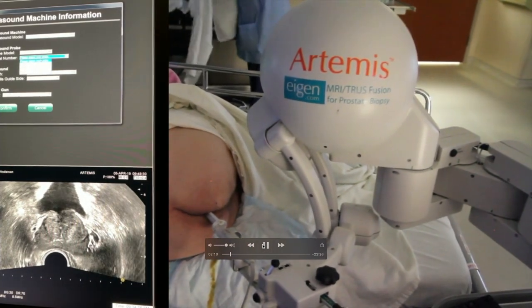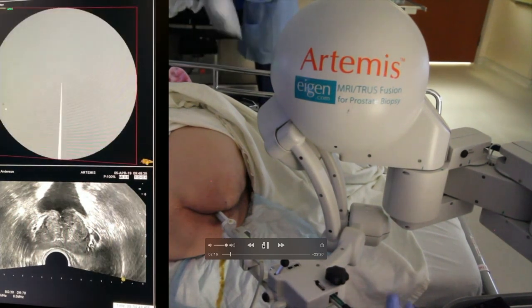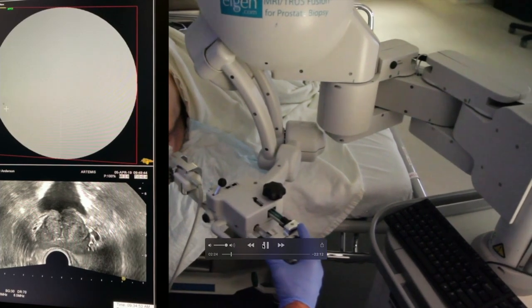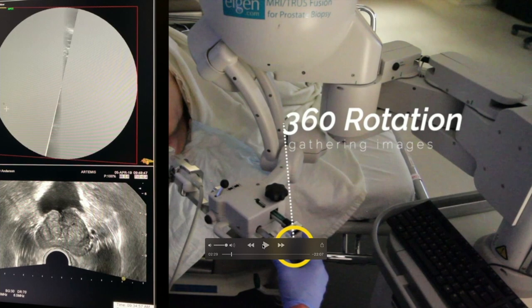Once you have that done, the ultrasound probe sits there—and that's one of the things I love about the Artemis: my hands are free. There's some Italian in me and I talk a lot with my hands, so I don't have to worry about holding the probe in place. Especially when you're doing computer work, your hand always tends to drift, and suddenly you don't have the same image you had before. With the Artemis device and this robotic setup, it stays right there. What you end up doing with the Artemis is gathering up a whole series of images.